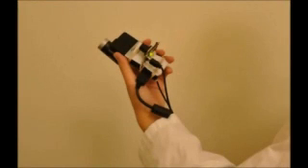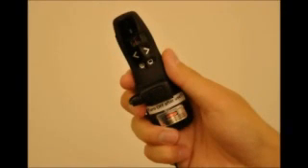In this video, we present AnatOnMe, a projection-enabled mobile device intended to improve patient-doctor communication in medical settings. AnatOnMe consists of two components, a handheld device and a pointer.